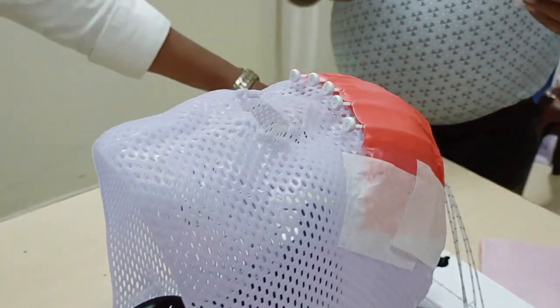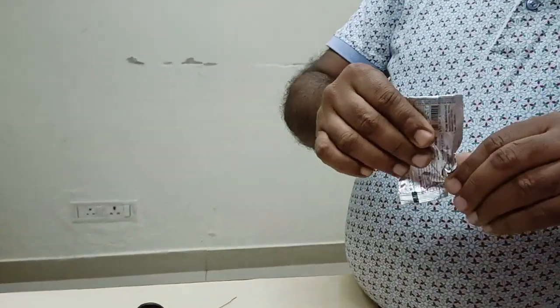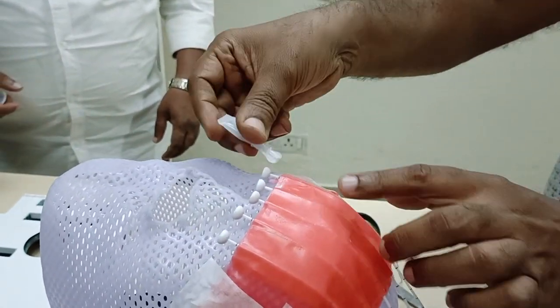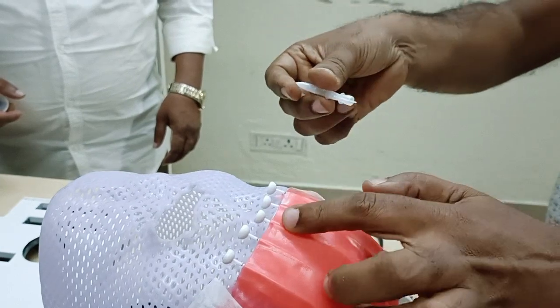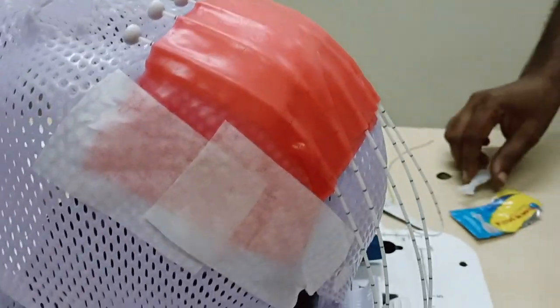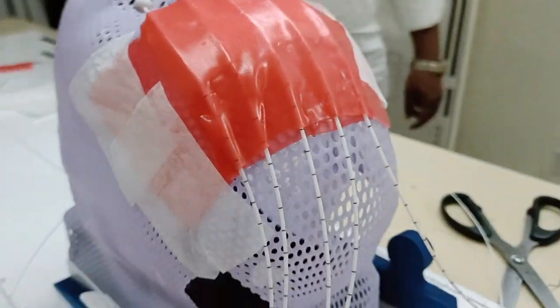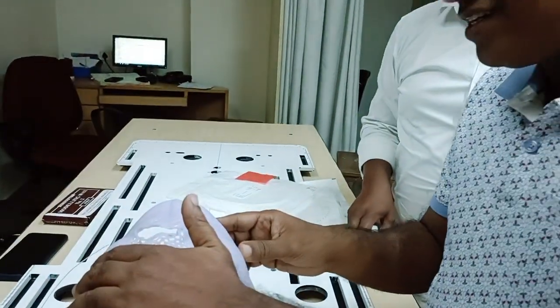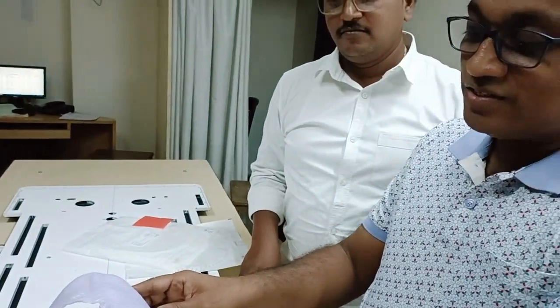Sometimes you can use easy fix or quick fix. When there is a problem, we can fix it with the mask using quick fix. It takes hardly five to ten minutes, and after putting this you can proceed. Thank you.